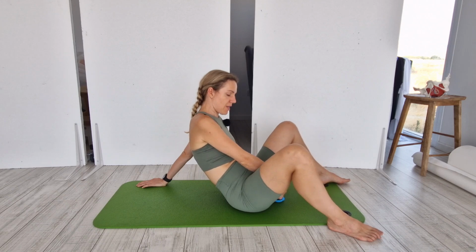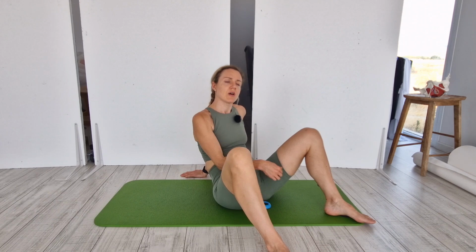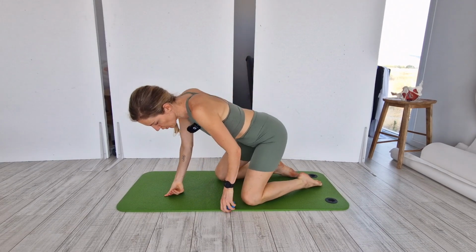So let's say I'm looking for my pessary, right? I found it just about the edge, but I need to get that pessary slightly lower. I'm imagining that I'm bearing down, and the actual prolapse, the organs, can push it slightly lower, enough for me to grab the edge and pull it out.